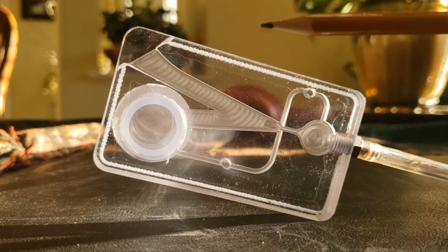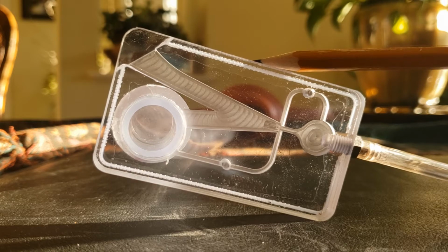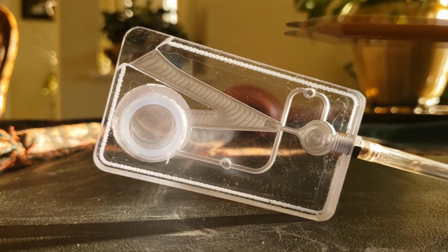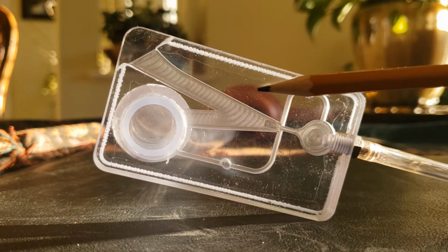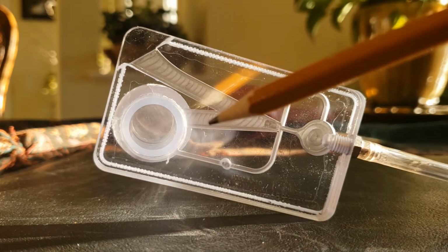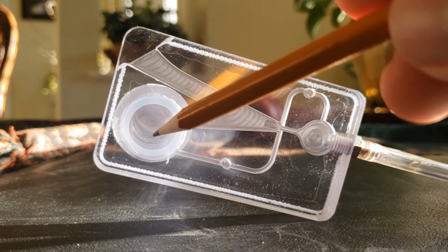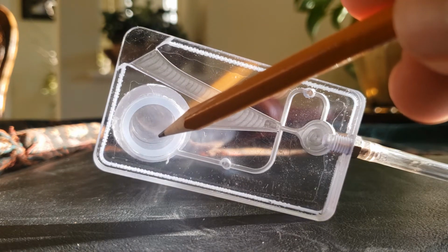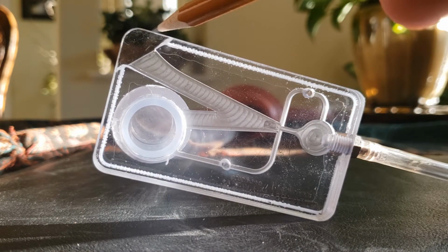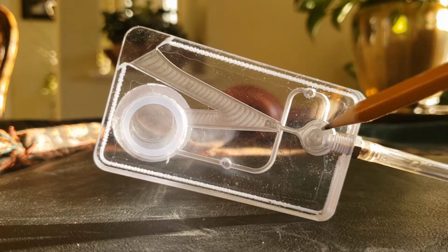This is the ARMEE, automatic respiration management exclusively for emergencies. It's just a simple device, 2 panes of plastic attached together with particular channels carved out. It has 3 ports, one that leads to the lungs, one that leads to the atmosphere, and one that is the input, where a high pressure stream of air comes in.